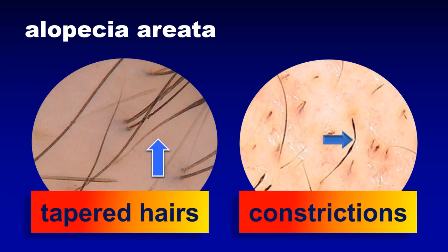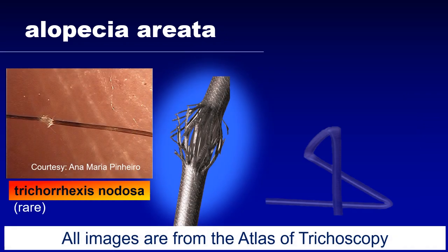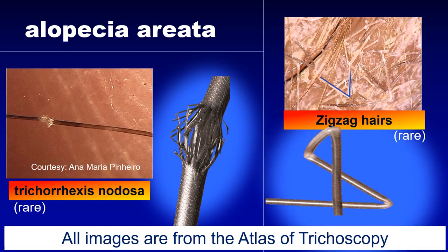These are images of typical tapered hairs and typical Pohl-Pincus constrictions in patients with alopecia areata. Talking about the constrictions, it is extremely important to not misdiagnose monilethrix as alopecia areata, because this may lead to very inadequate treatment decisions. Sometimes a predominant feature in the patient is a non-specific feature such as trichorrhexis nodosa or zigzag hairs, which may be present in patients with alopecia areata.